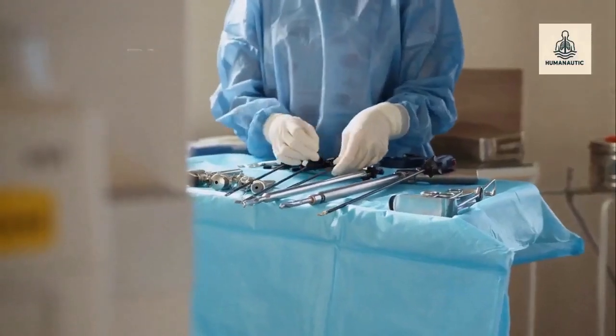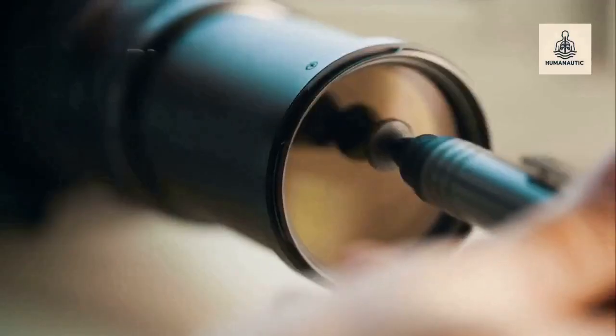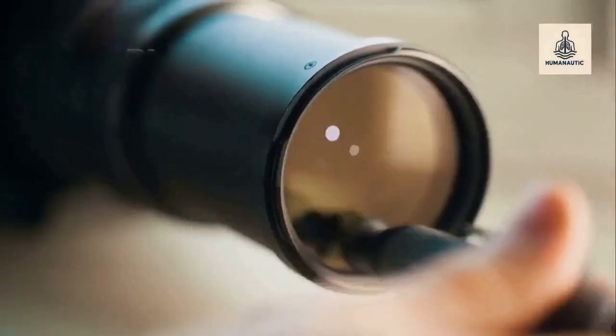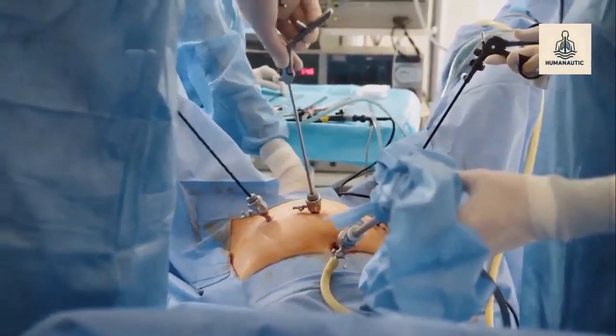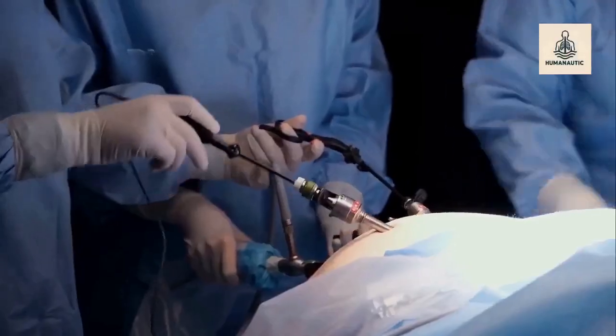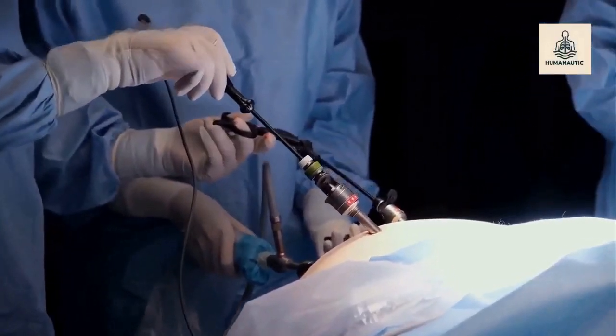Key principles students should know: white balancing and focusing, preventing lens fogging, relying on visual cues because tactile feedback is limited. The precision of laparoscopic surgery depends heavily on clear visualization and controlled camera movement.